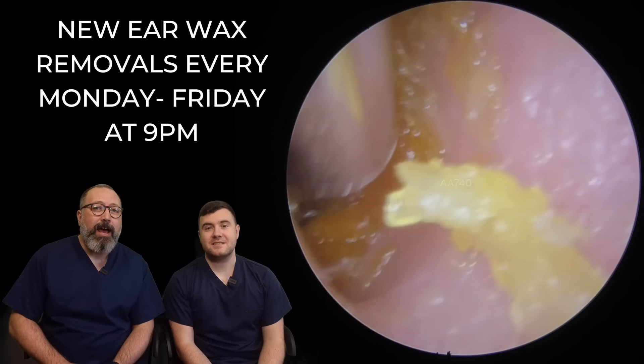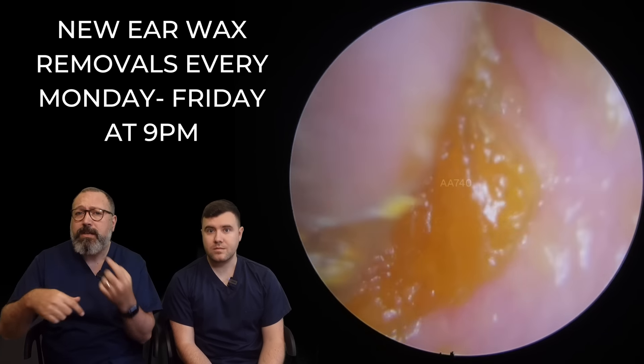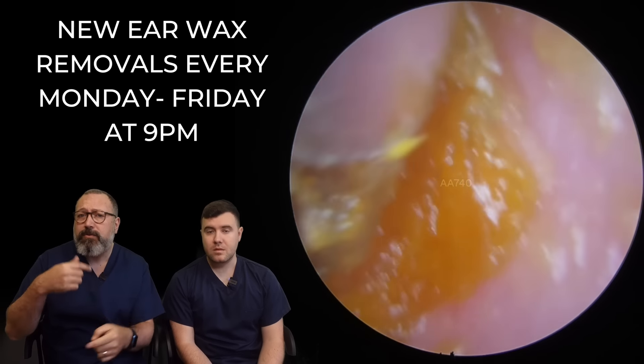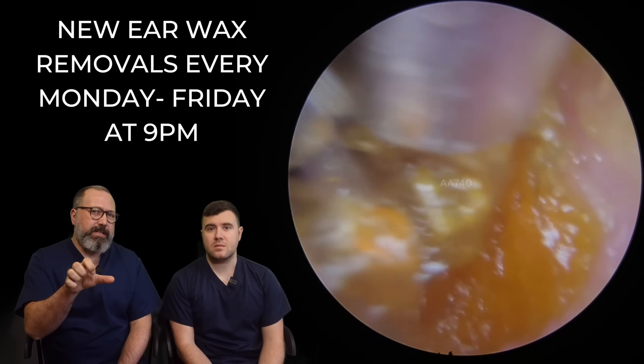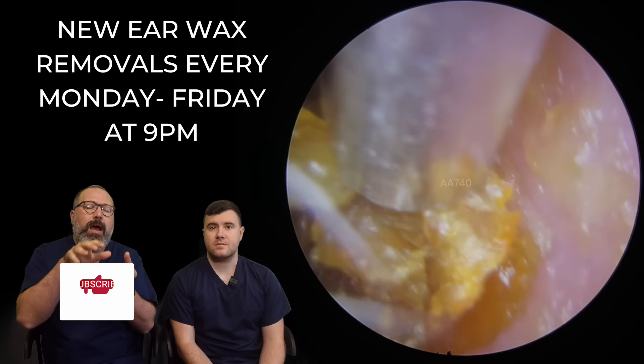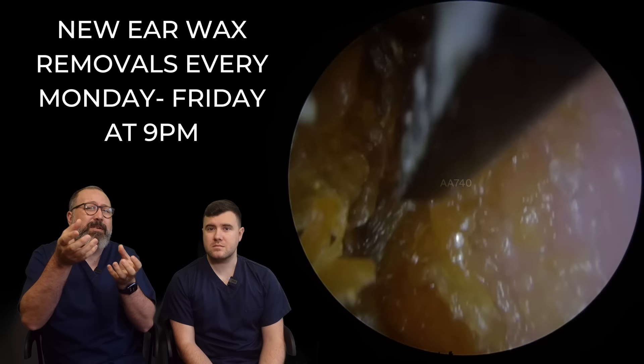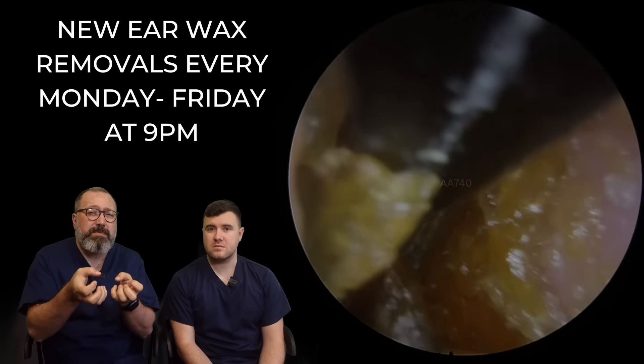So this is actually my patient. This is a patient that comes through quite regularly. Taylor saw this patient about three or four months ago, and this patient has to come through on this real kind of cycle every three, four months thereabouts, because they get this really big buildup of skin. Now, this skin here is this tough skin, this keratinized skin.